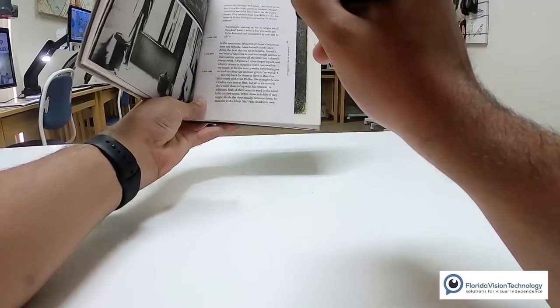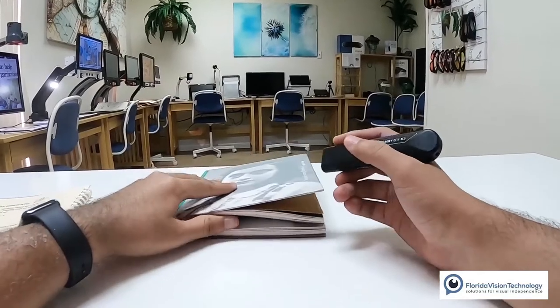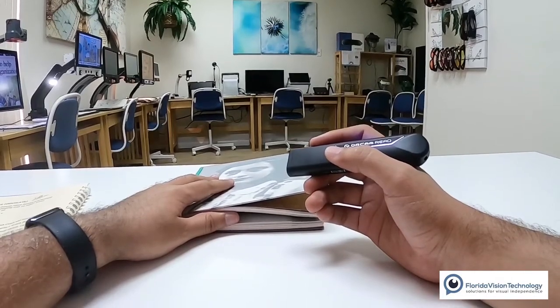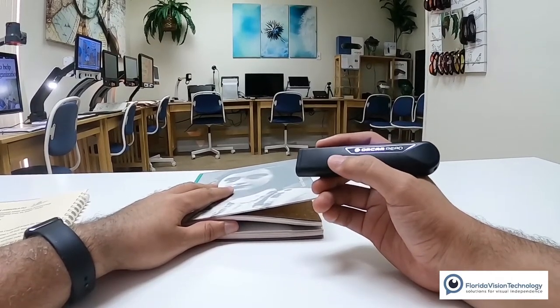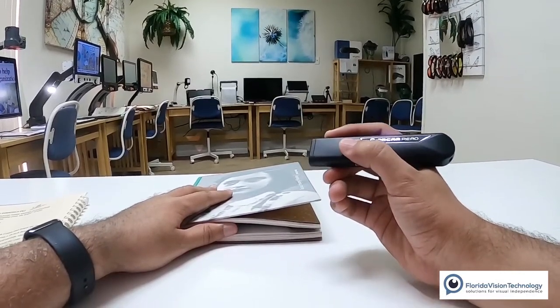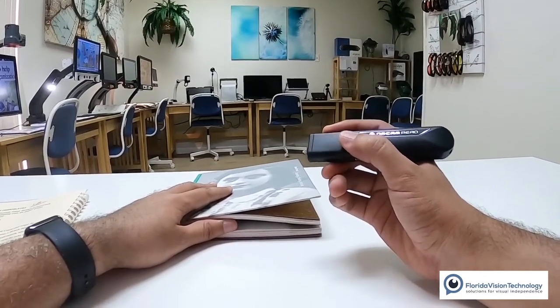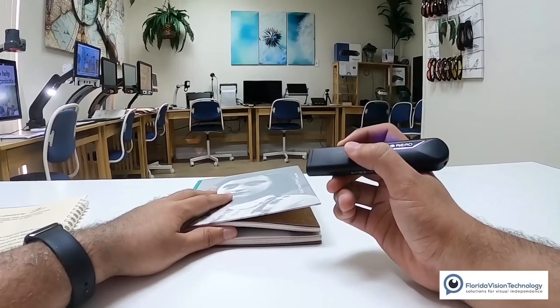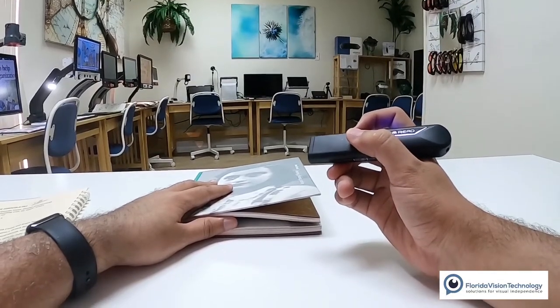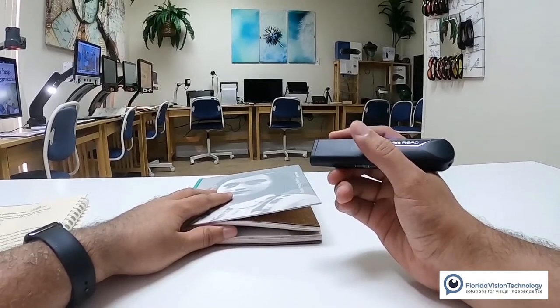And it starts reading: 'Candy — her father gives her a long birthday poem in German, translates part of it into Dutch. As the poem shows, Otto understands how difficult it is for Anne to be the youngest person in the Secret Annex.' Now I could double-press that trigger button to pause, double-press it to resume, press the plus to go forward a line, press the minus to go back, and press that trigger button one time to stop it from reading. It's that easy.